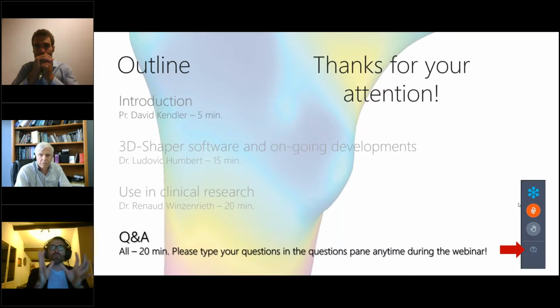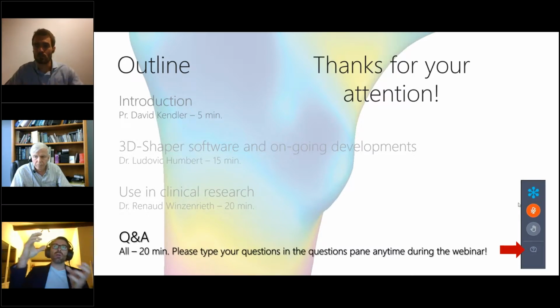Usually, what I do when I make an analysis is that I start with the overall femur, using only values, using the trabecular volumetric density and the cortical surface BMD parameter. I have a first idea of what's going on. Then I split the cortical surface parameter in cortical thickness and density. And then I go directly to the 3D mapping. And with that, you can have a better idea of if you have a global effect or a local one.